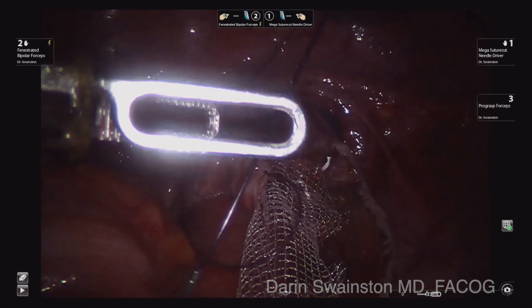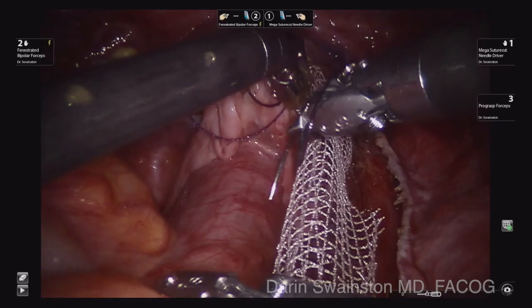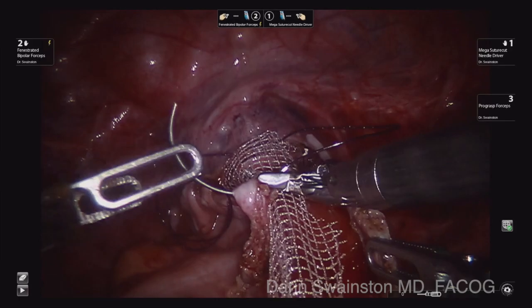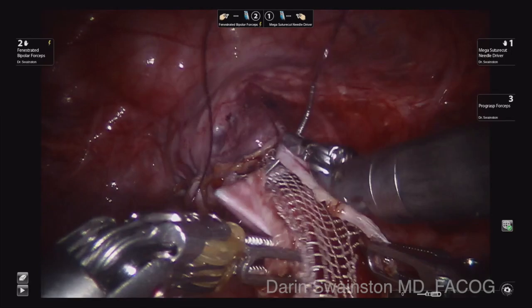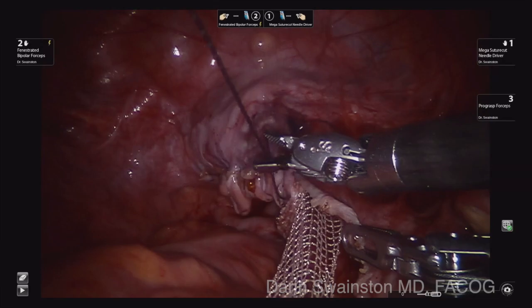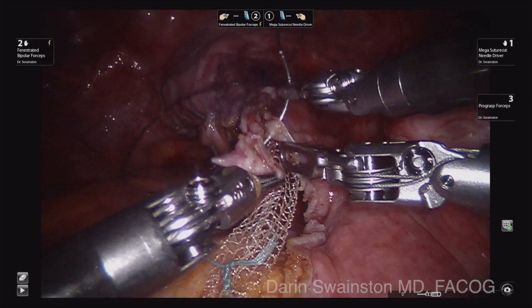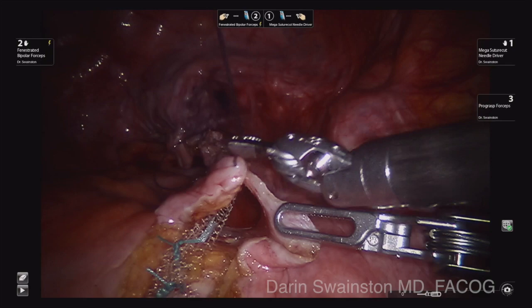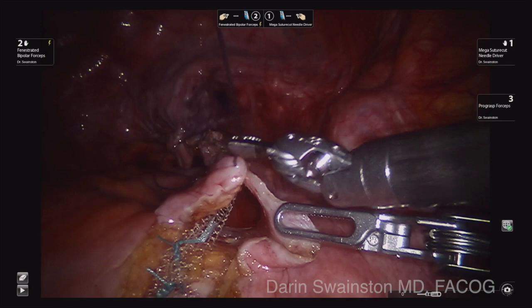You do not have to have these two very close together, but you just do not want mesh showing — you want them nice and snug. At one point I do not quite get the mesh closed the way I like, so I go back and fill that area in. I take a bite up here and go back down — I don't want to see mesh. So I work down to the very edge to cover it. The third arm helps keep the peritoneum up. I stayed completely out of the ureter on the right. But if you get a little too close to the ureter, you might almost have to take the ureter down off the peritoneum so you do not take a risk.